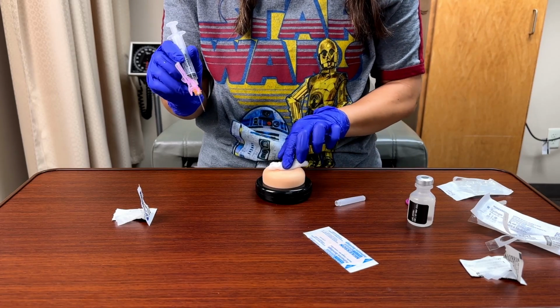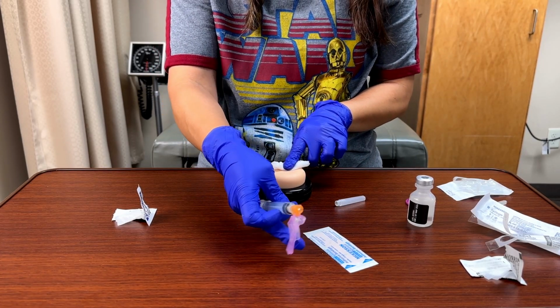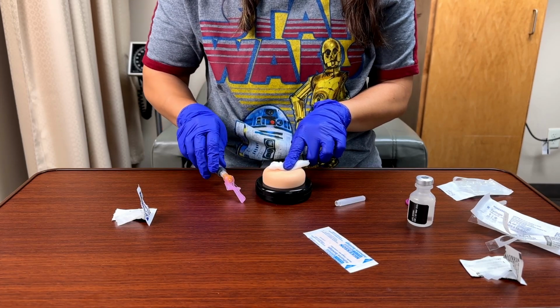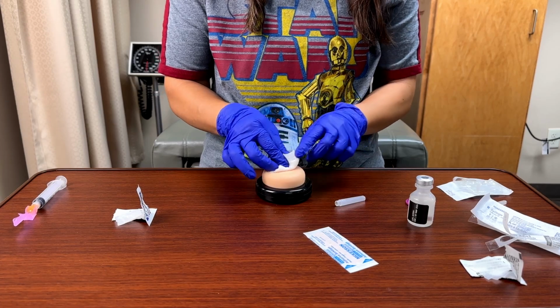And I'm going to apply my cotton ball or cotton swab. That's what this lock is for. You're going to use it to lock your needle. So you'll lock it just like that. And we'll dispose that in our sharps. And then I'm going to place a Band-Aid.